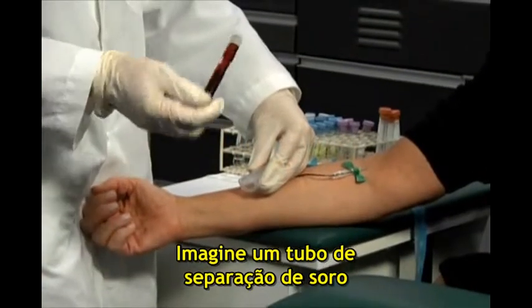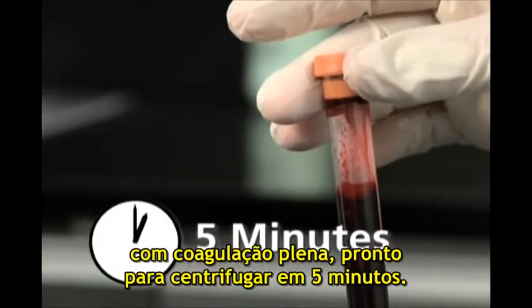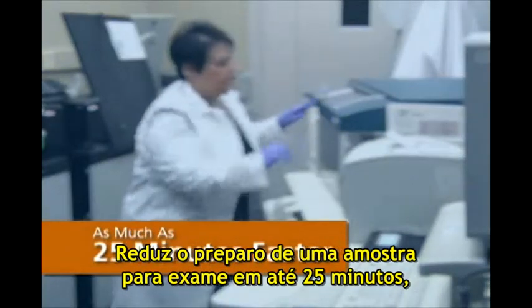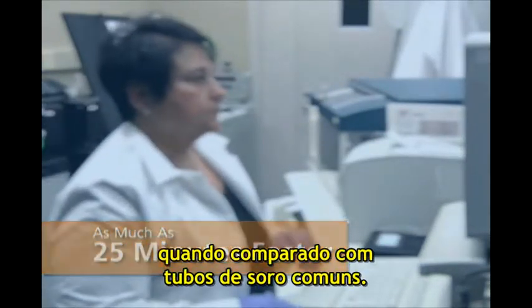Imagine a serum separation tube that's fully clotted and ready to spin in only five minutes, shortening the time it takes to prepare a specimen for testing by as much as 25 minutes compared to standard serum tubes.